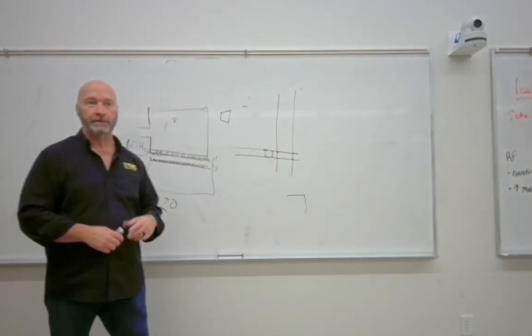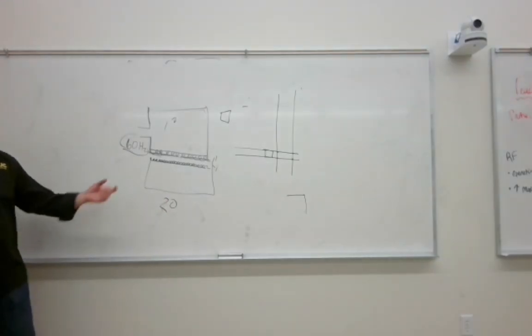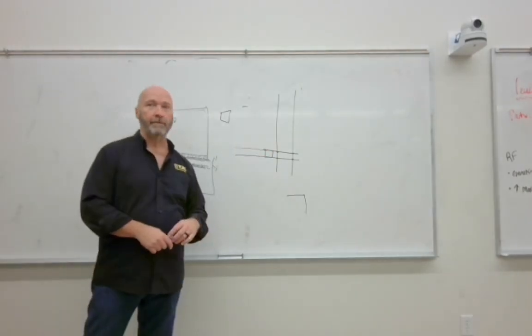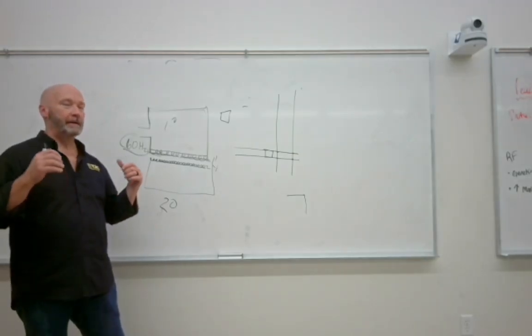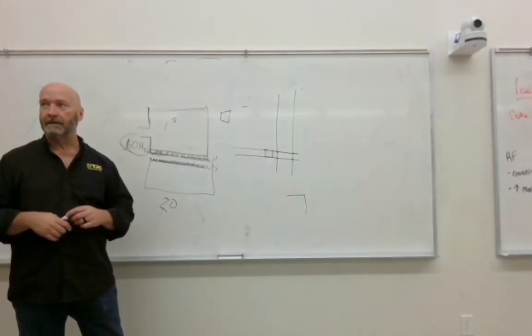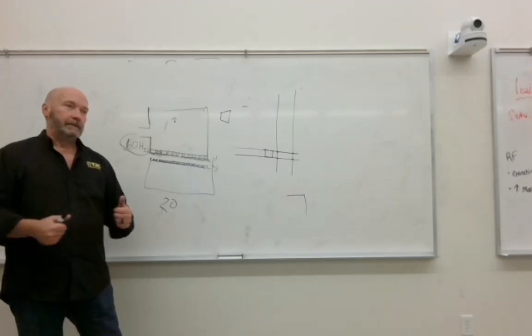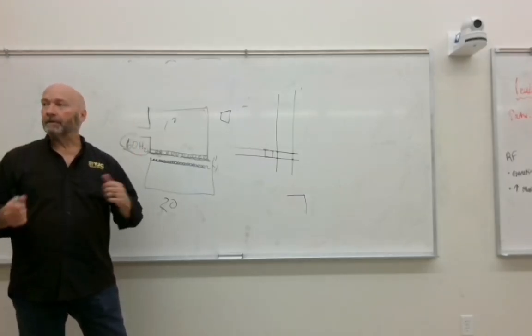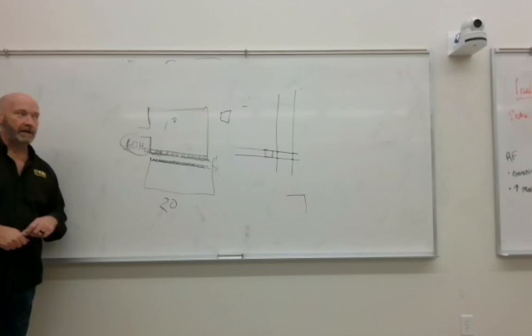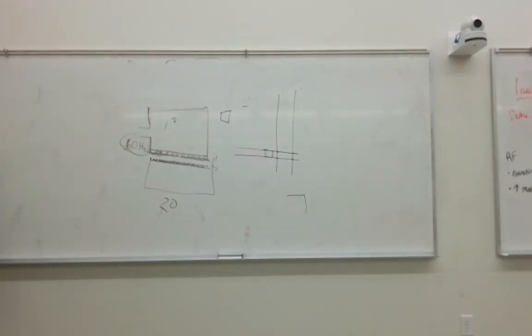They're activated with solenoids. So where we use solenoids, not just in the doors, but to move the table and also to move the tower as well. They should have preferred areas where they stop, and that's in this chapter. That's what we're referred to as the detents. You let go of it, it locks into place where it is, at 72 inches, 40 inches, whatever. Okay, so just electromagnets, fundamentally. So I don't think anybody asked that question, but now you know.